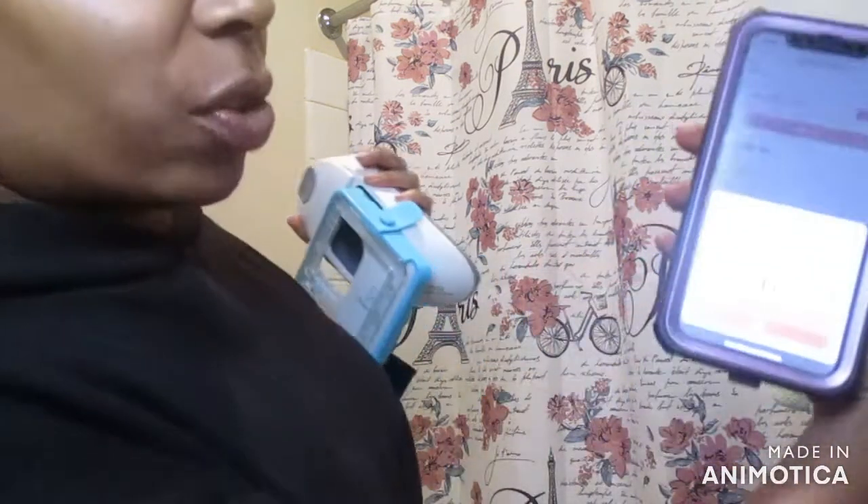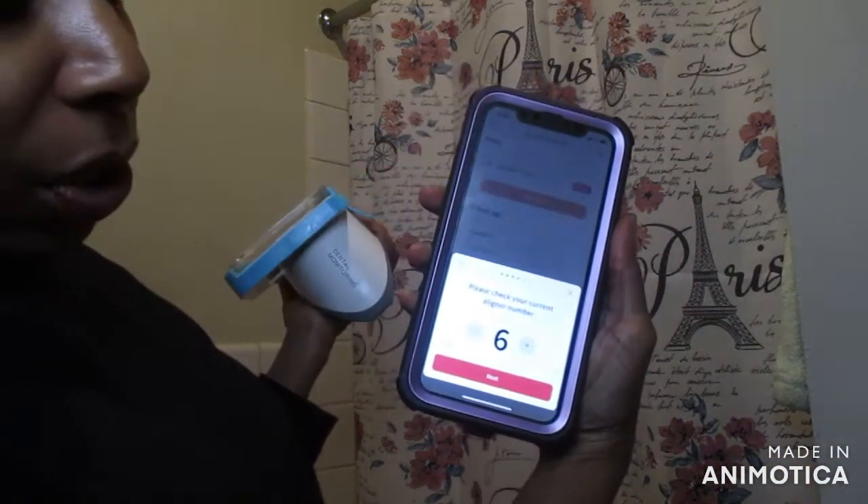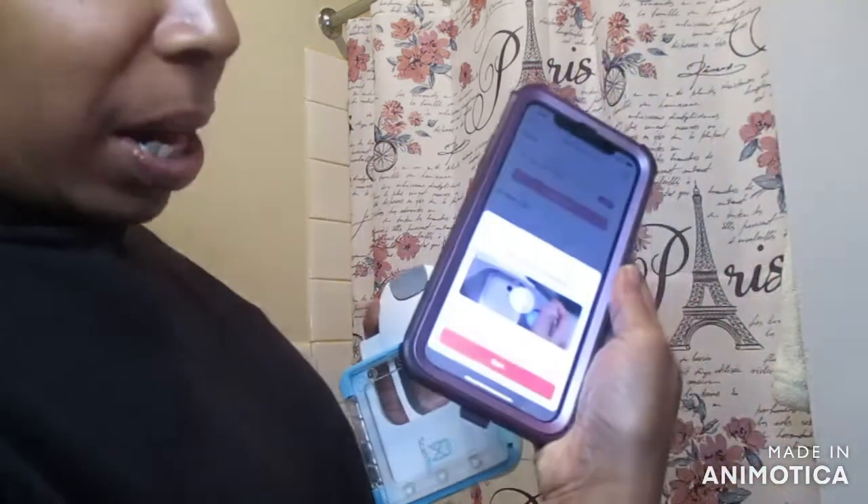So my aligners are out. This is the scan box. What I'm going to do is go ahead and start to assemble this. It tells you to remove your aligners and lets you know what aligners you're just now getting out of — I'm in aligner number 6. I'm about to go up to number 7 if everything is copacetic. Now it's telling me to go ahead and set up my box. Place your phone into the scan box and latch it in. Insert the cheek retractor and snap the scan box into place.